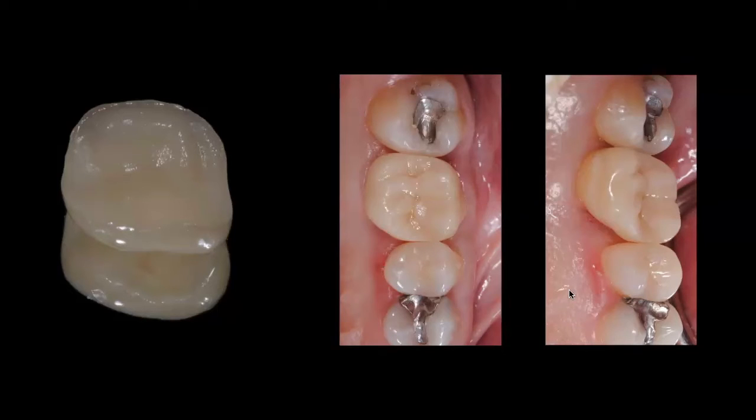What you're seeing here on these right-hand side photos, you can see my onlay restoration delivered on that first molar. On the first photo, you can see the occlusal view. But on the right-hand side, you can see a lingual view where you're seeing that biorim that has been kept intact. So this partial coverage restoration still has that full strength of the tooth. This is a biomimetically restored tooth, and we've decided to maintain that strength of the tooth by using a partial coverage restoration.